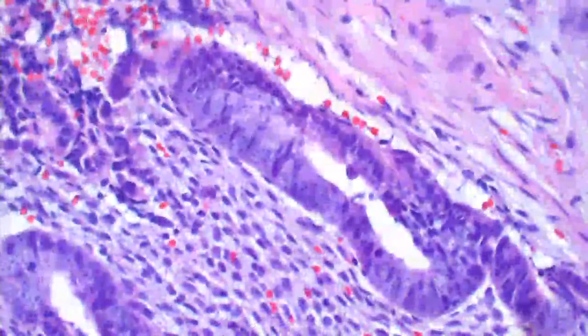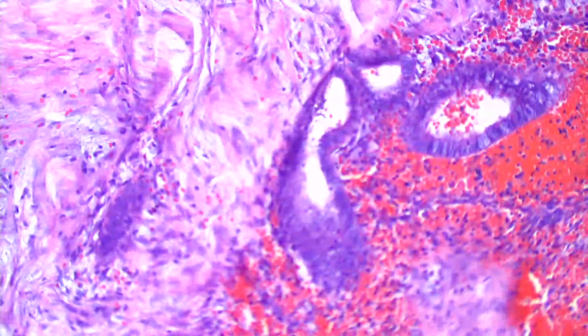This wasn't a met, was it, Mokhtar? So I think you see something that looks glandular, and it's got a lot of red blood cells in the glands. There aren't too many other benign adnexal neoplasms that tend to have that. Is that part long enough?